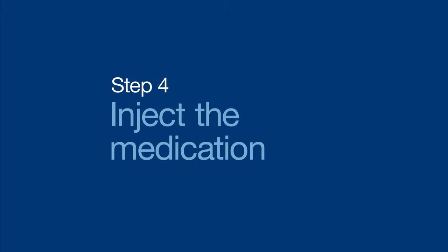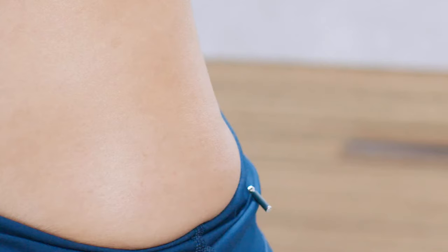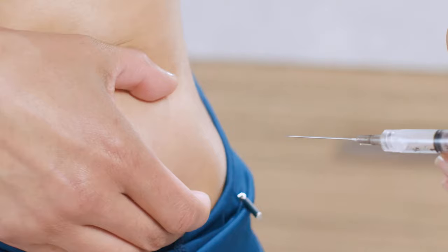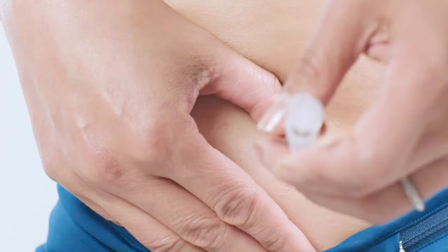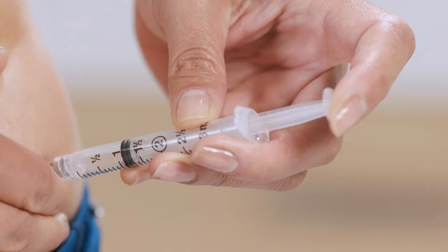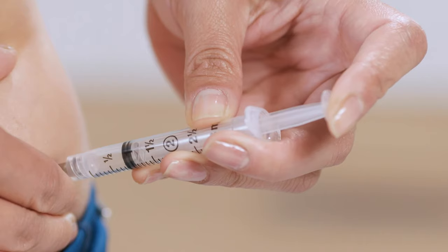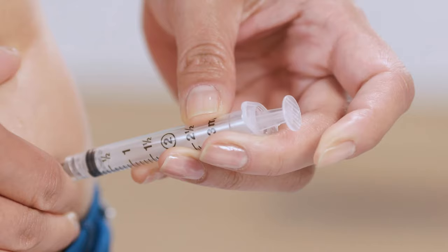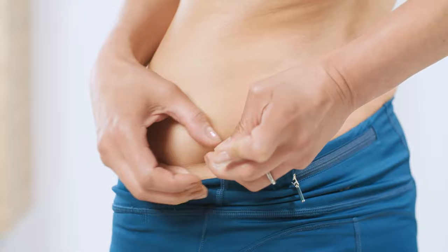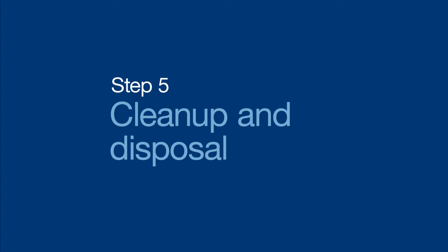Now you're ready for the injection. Remove the needle cap and hold the syringe with one hand, then use the thumb and index finger from your other hand to firmly stretch the skin around the injection area. Using a quick, dart-like motion, insert the entire needle straight into the skin at a 90-degree angle. Slowly push the plunger until you've injected all of the medication. Do a quick count of one, two, three. Press down firmly on the injection area with a gauze pad and remove the needle. And you did it — nice job!